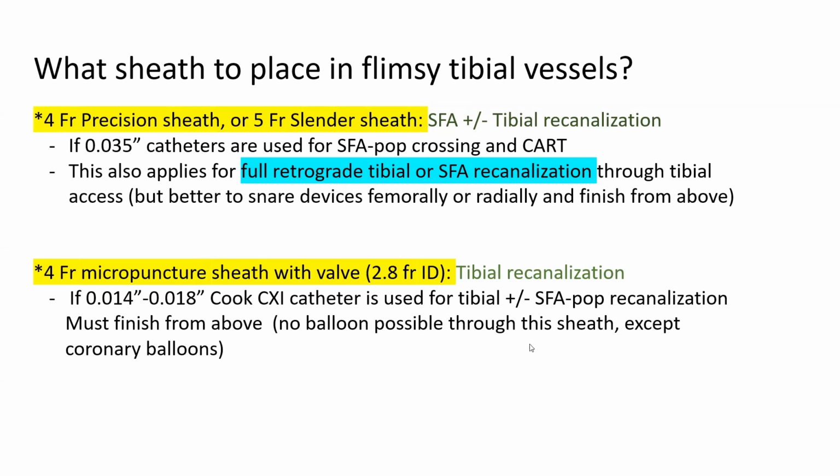So to answer your question, TR band, as little pressure as possible to achieve hemostasis for 1 hour, maximum 1.5 hours, then I deflate it fully. And before that, as you put it on, verify there is flow, whether via femoral angiography or via ultrasound Doppler waveform.